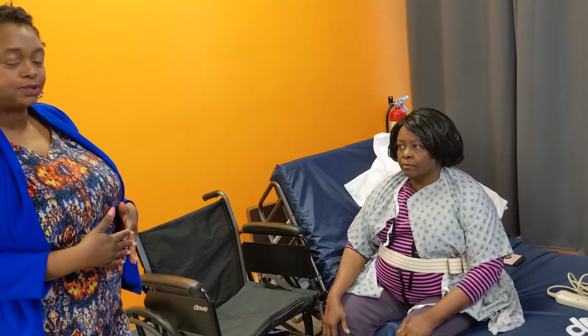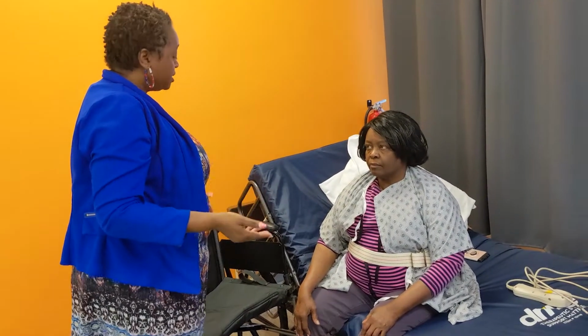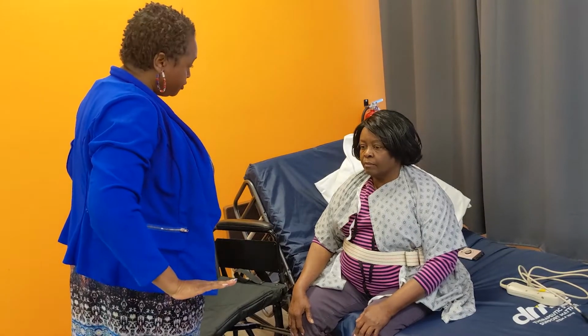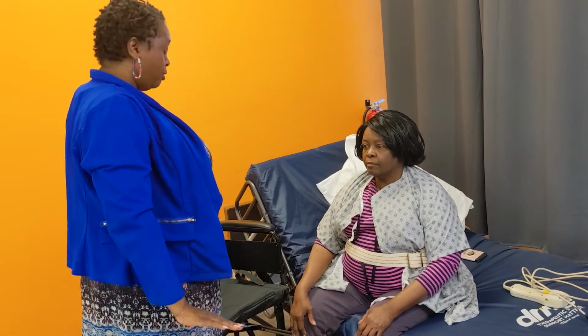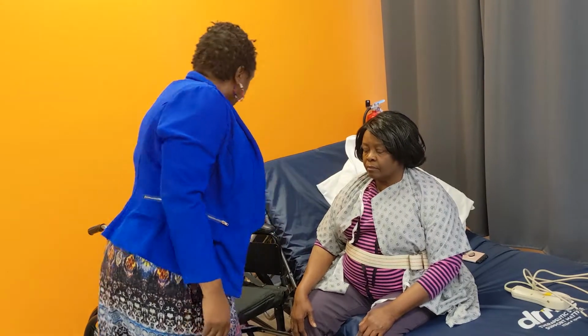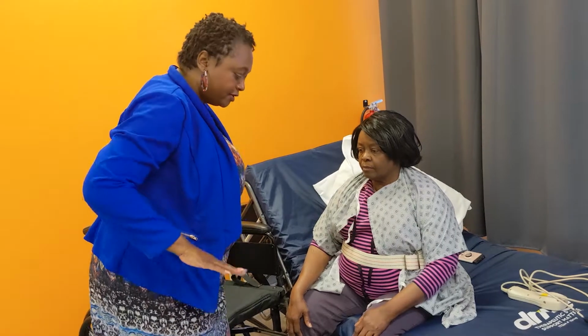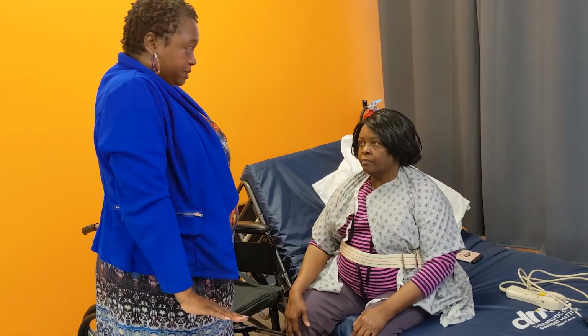And now here, I make sure I explain to the patient what's going to happen. So on the count of 3, and you could write these down, these are words you're going to say. On the count of 3, I want you to take both arms and push up. I'm going to help you stand up. Then I want you to take this arm and reach for this arm rest, okay? On the count of 3, you're going to push up. I'm going to help you stand up.